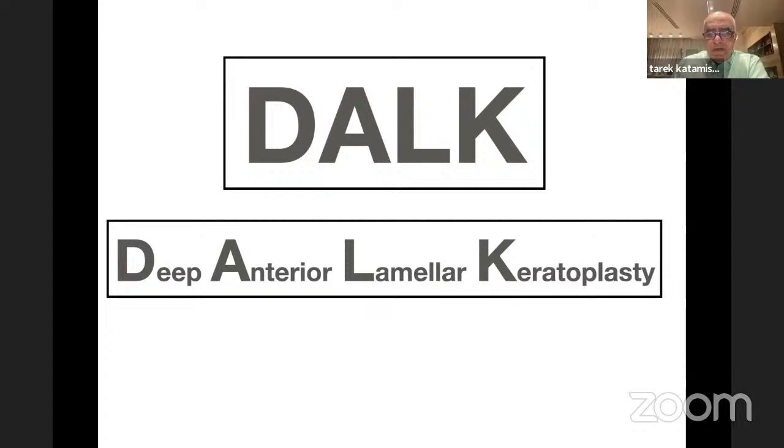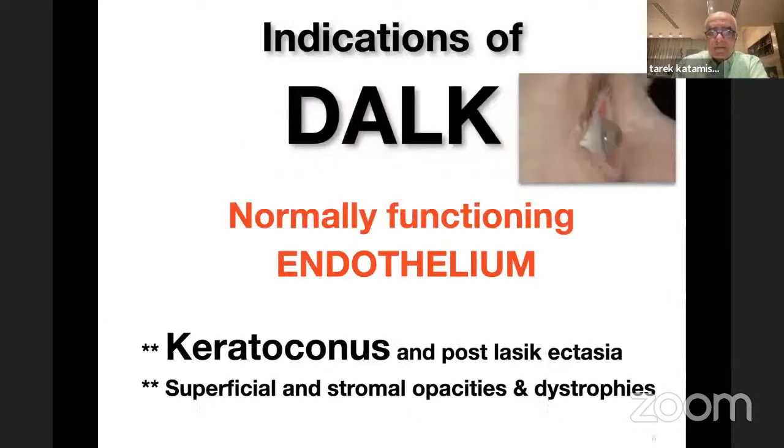We have been doing this operation for many years and many decades, but we are speaking now about the recent form of this operation, where we reach very, very deep, near to Descemet's membrane. That's why we call it DALK, or deep anterior lamellar keratoplasty.